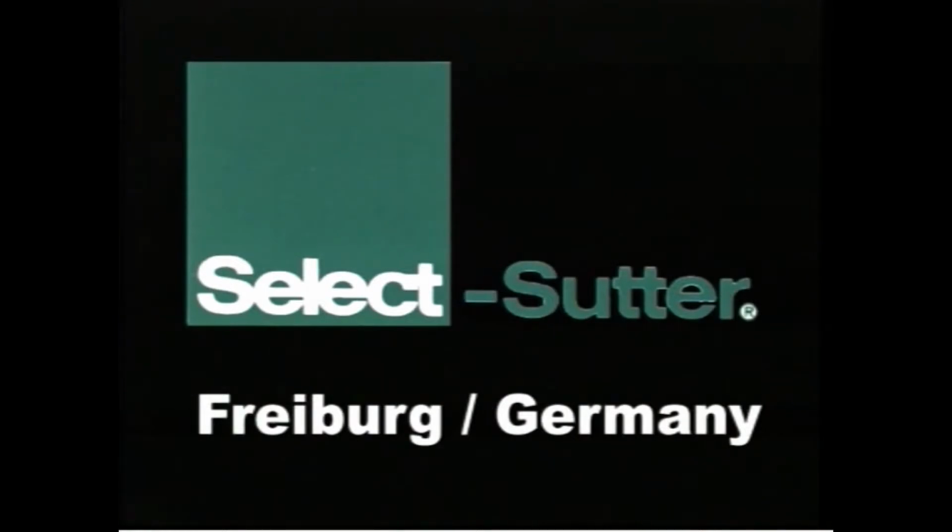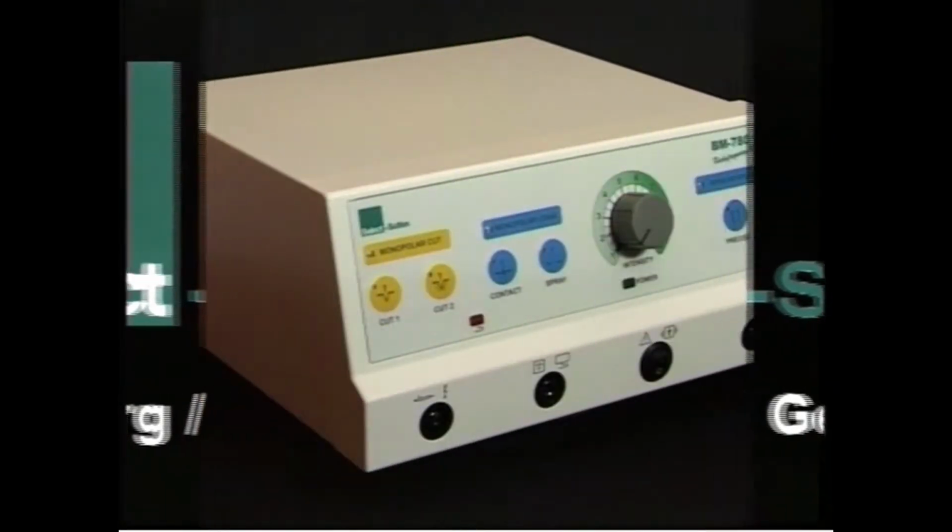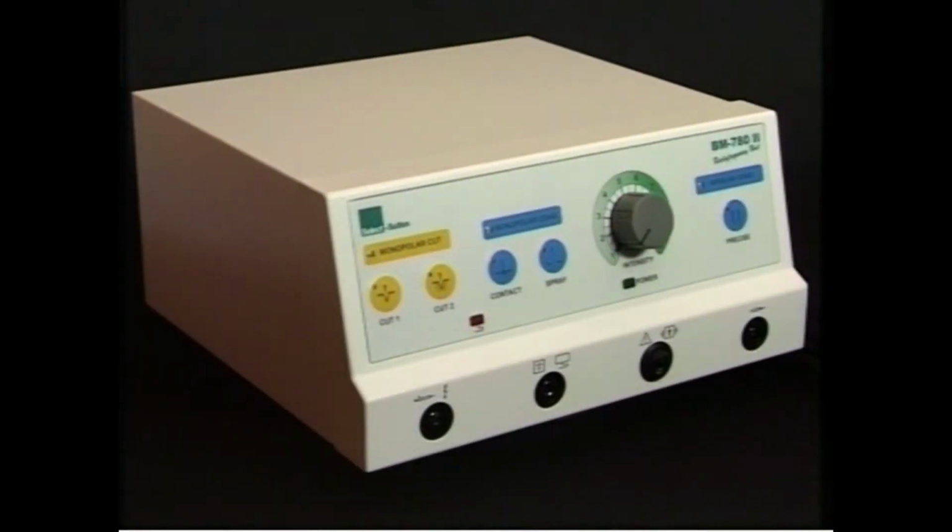Please return the enclosed confirmation card to the manufacturer. You are not permitted to use this appliance in any way other than that described in this video presentation or in the written operating instructions, because that could endanger the user, the patient, or a third party. The RF generator BM-780 Mark II may only be used by persons familiar with its functions, applications, and effects.